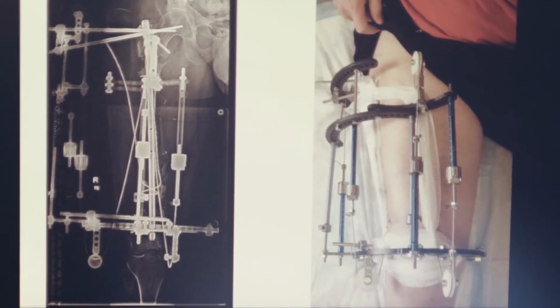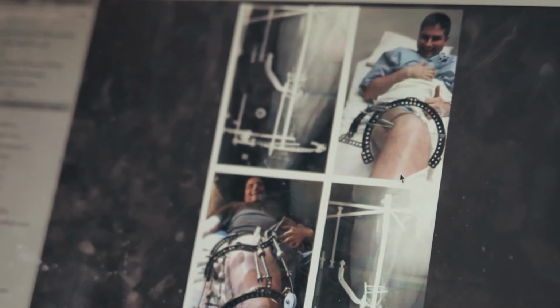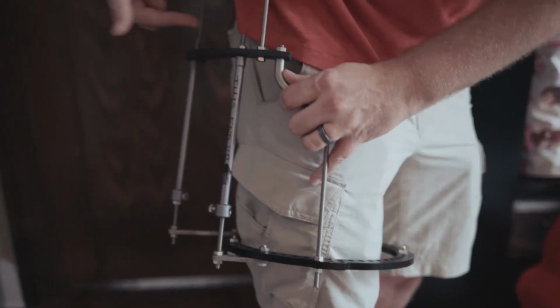And at this point, he had already been through a huge amount of surgery with the external fixator using this bone transport over nail technique. And it was too much to try to get those 2 inches back through the femur. But to leave him 2 inches short just was not an option. So what's the solution to that? Well, we're gonna lengthen your tibia bone.